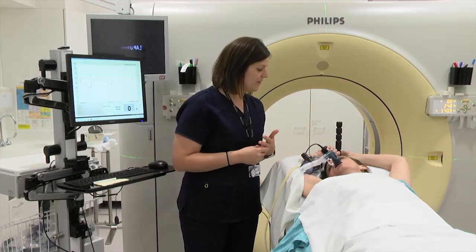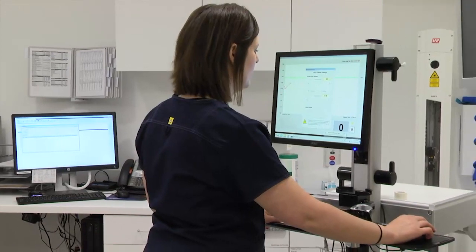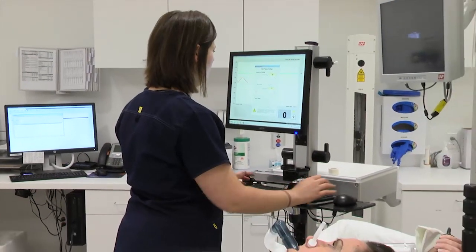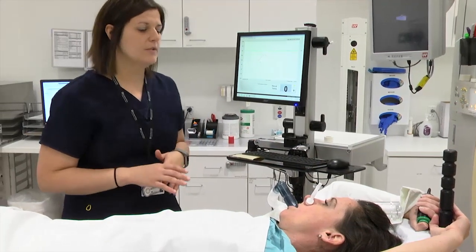The therapist will also put a clip on your nose to keep you from breathing through your nose. The therapist will ask you to practice deep breathing a couple of times. As you are doing this, the therapist will set your personal settings on a computer to mark how deeply you can breathe and how long you can hold your breath.